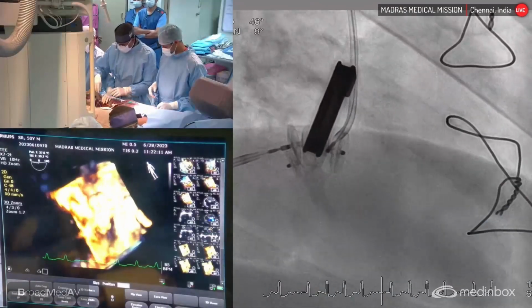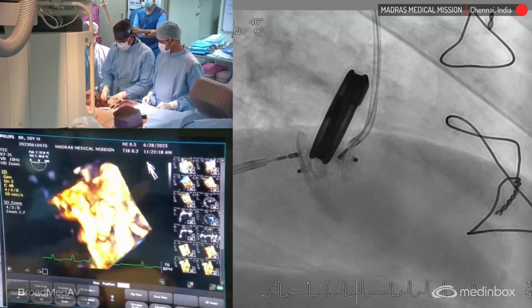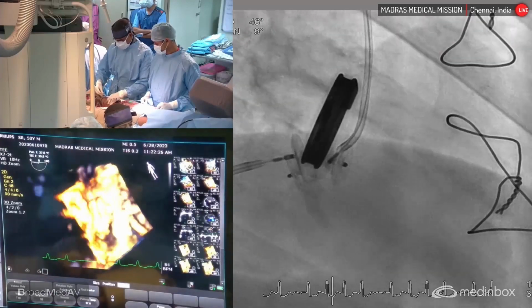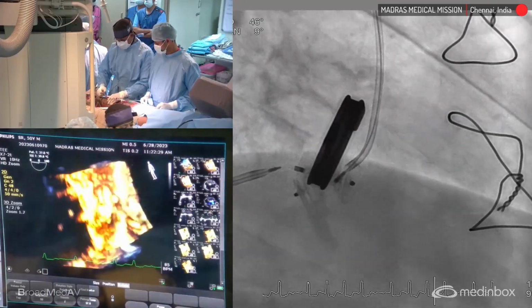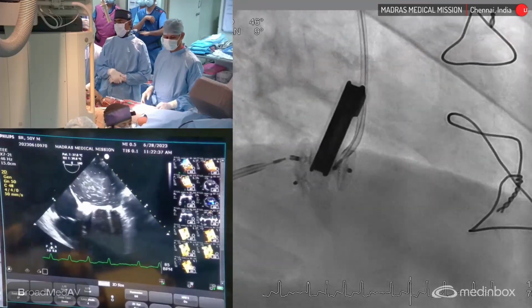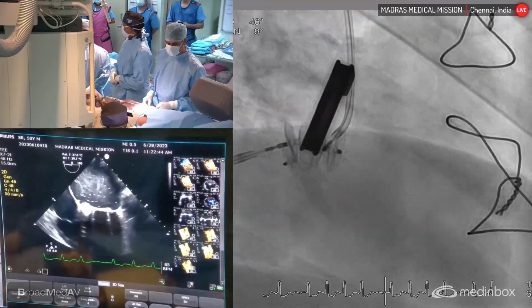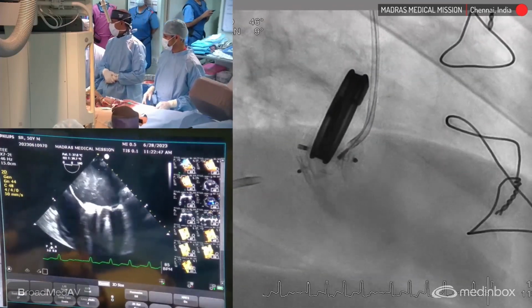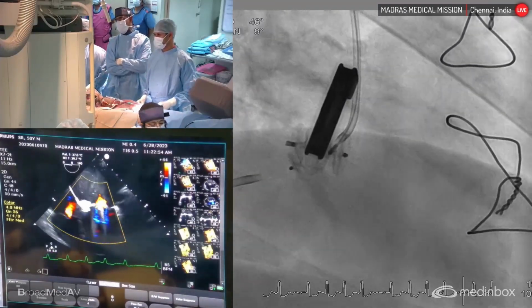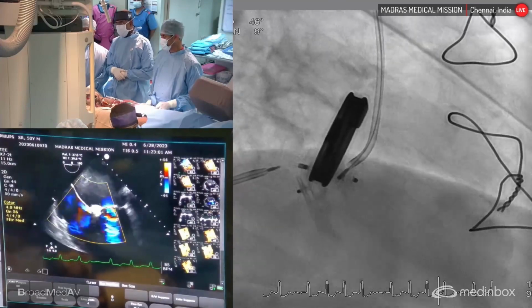Now I get my left atrial pressure free for assessment. So I'm going to assess the left atrial pressure now through this guide catheter. Now, there's a lot of spontaneous echoes because of the atrial fibrillation, which I am planning to electrically cardiovert. What do you feel, Dr. Pramod? Even though the left atrial size is about 8.5 centimeters, this patient's previous ECGs at some time have shown sinus rhythm, and so would like to give the benefit of the doubt. Now, there is no paravalvular leak. There are some valvular leaks within the valve housing. The paravalvular leak is completely gone, right? Okay, so that's a good sign.